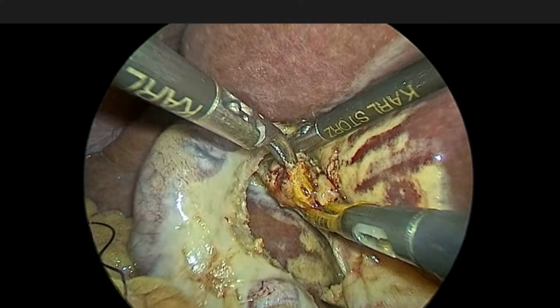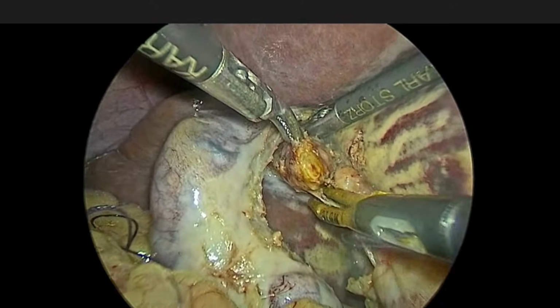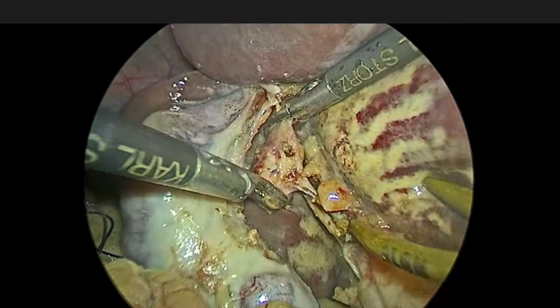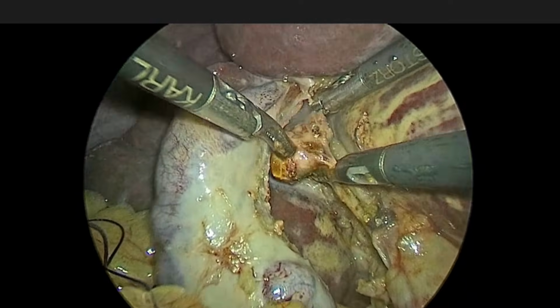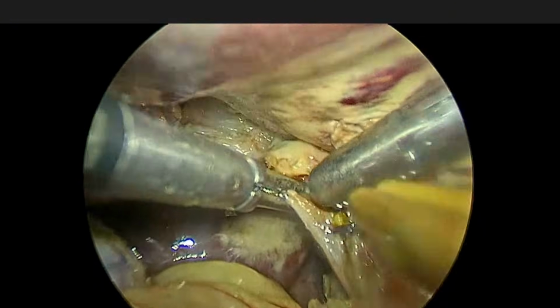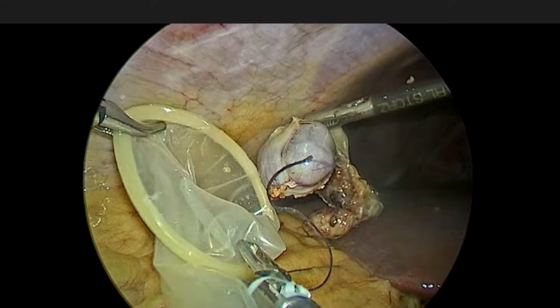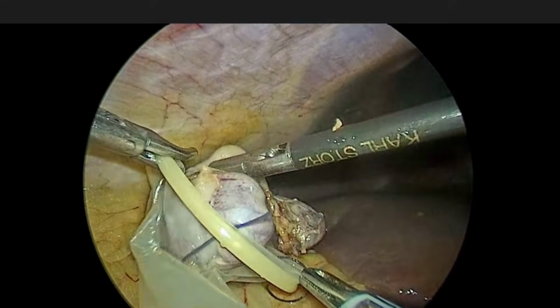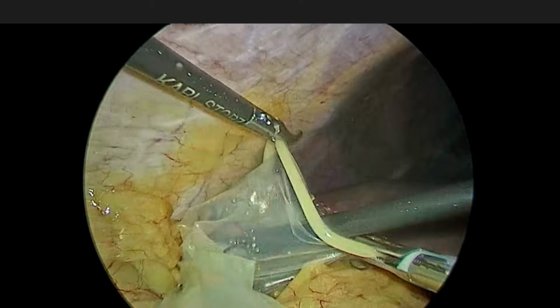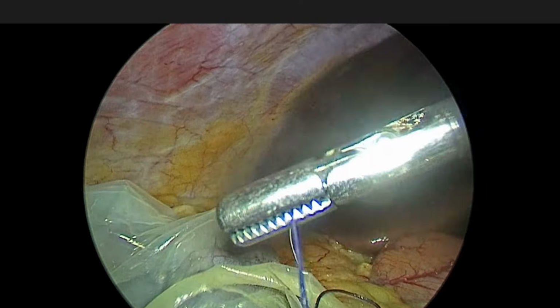Now we are completing the division using ligation. Now the specimen is put into the condom, the needle with the remaining thread.